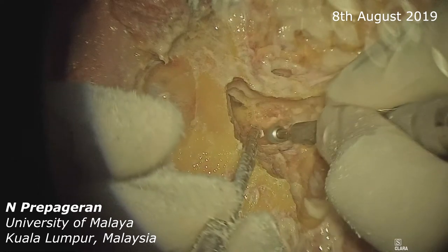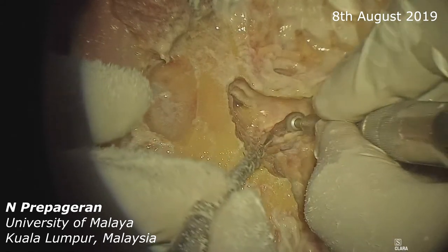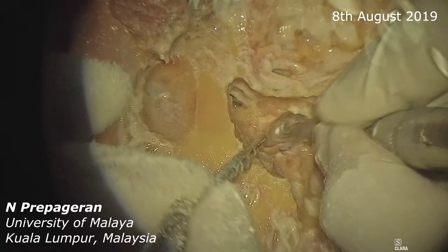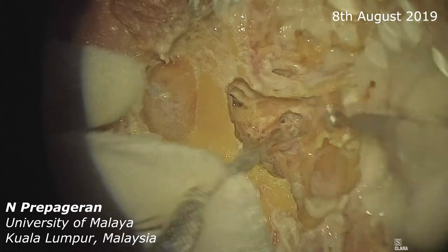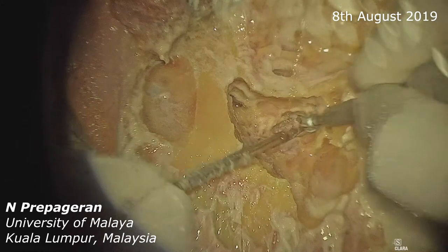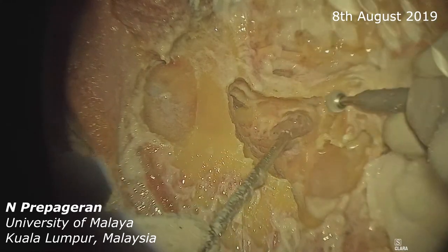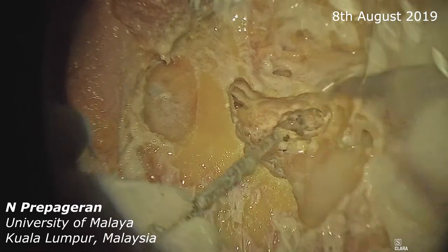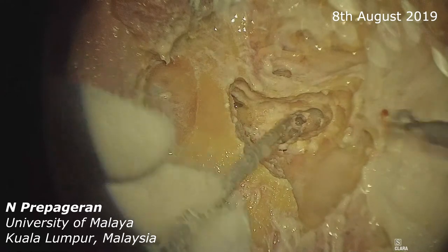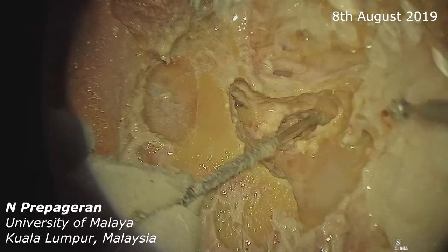So now I'm going pre-sigmoid. The sound is changing as well, so I know that we are very close. Now we are going under the labyrinth. That's the posterior semicircular canal coming into view. We're going under the labyrinth now, as you can see. And here, if we go lower down, we will be going into the jugular bulb. Now I'm going to drill downwards so that we can go to the mastoid tip, and then you'll also find the digastric — that's the digastric coming into view.